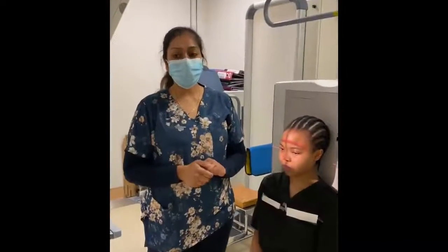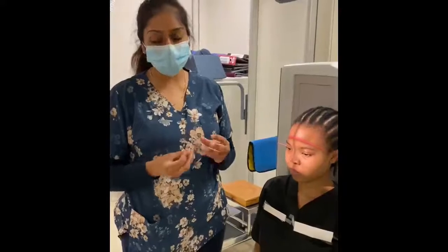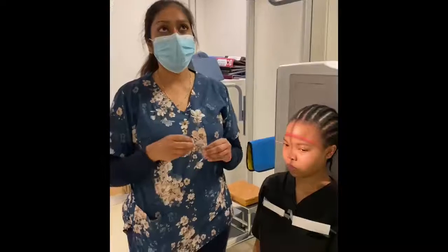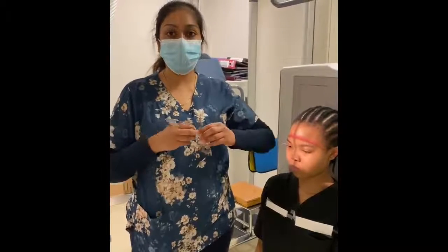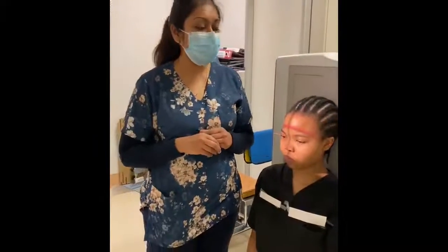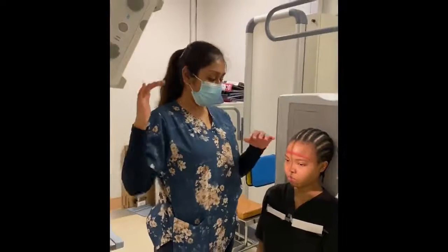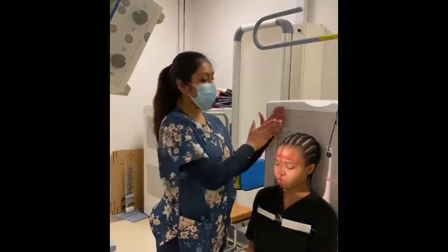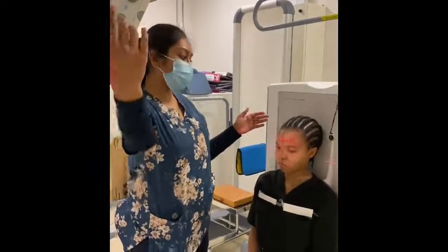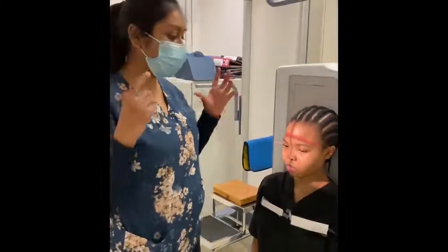Okay, so now for your zygomatic arches, we're going to demonstrate your AP axial view, or it's called a modified Towne's method. Those of you that have been for your clinical practice of your skull would be more familiar with this view. Basically our beam is going to be entering from the frontal aspect of the patient, exiting at the occipital area of the patient. For this view, we're just trying to demonstrate the zygomatic arches.